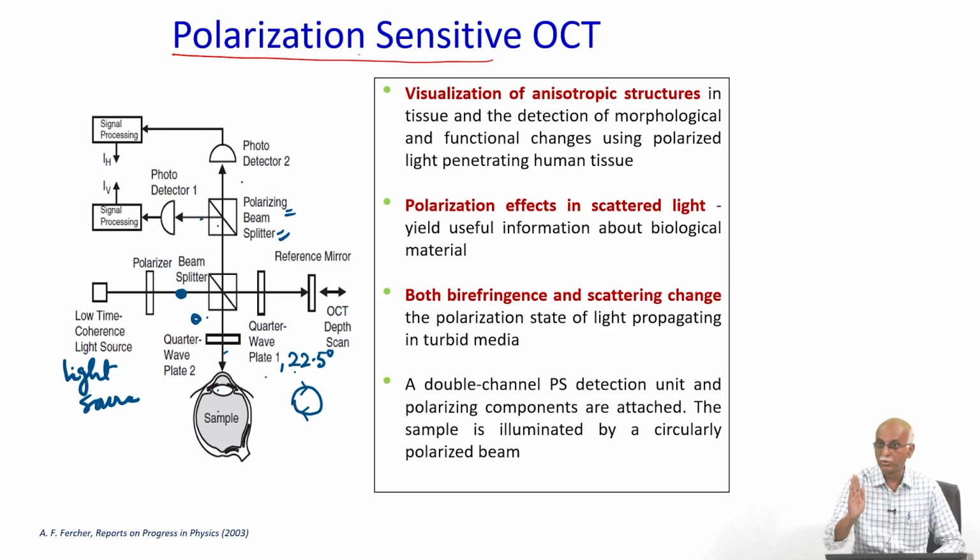When they travel through the medium, depending upon the medium's refractive index along the x axis and y axis, the speed with which the wave propagates will be different. So, when you see the reflected signal, the polarization has changed by some amount.